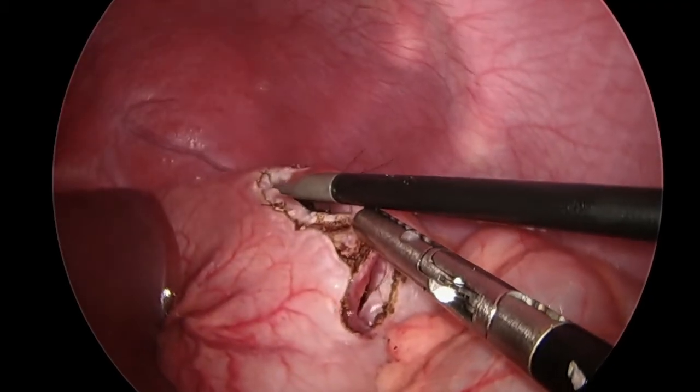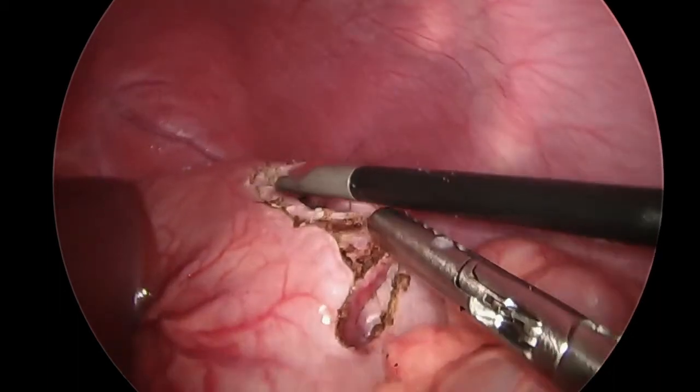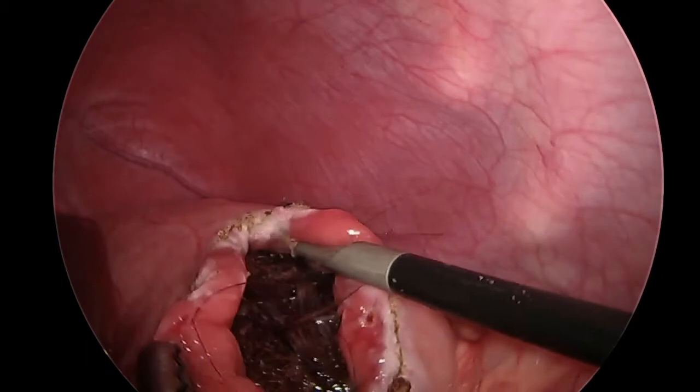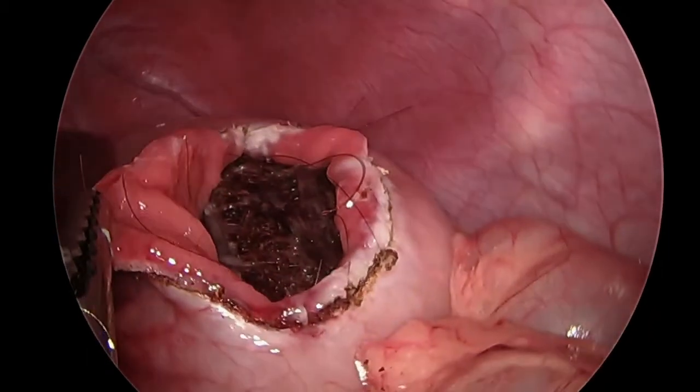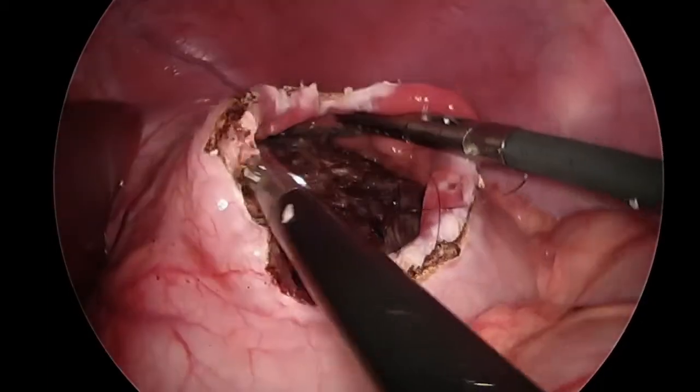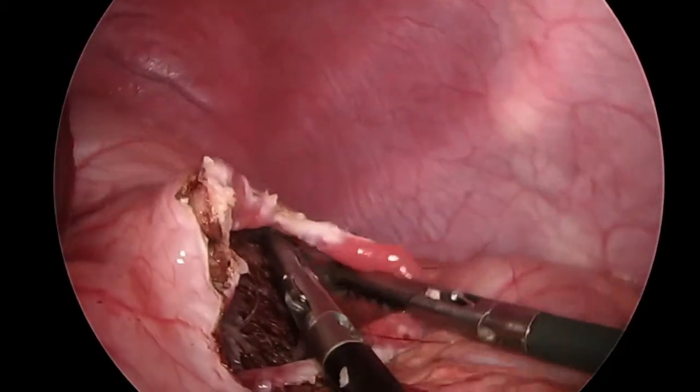Pneumoperitoneum was established using a Veress needle. A five-millimeter umbilical port was inserted, followed by a further two ports in the usual position for gastric surgery. The umbilical port was later upsized to 10 millimeters to facilitate introduction of the suture into the abdomen.